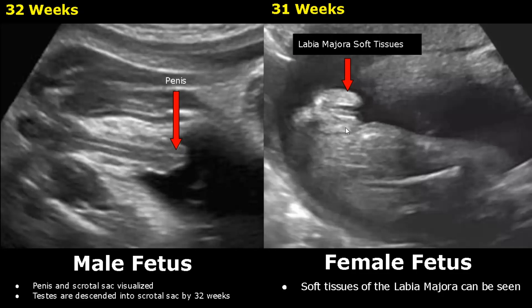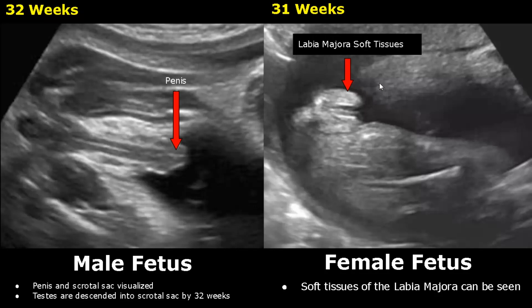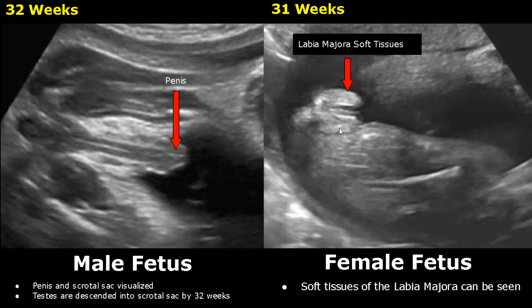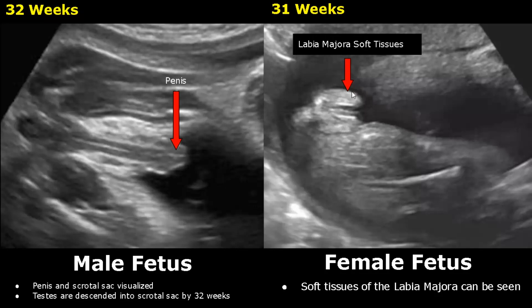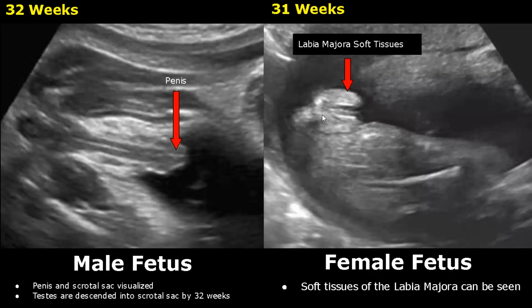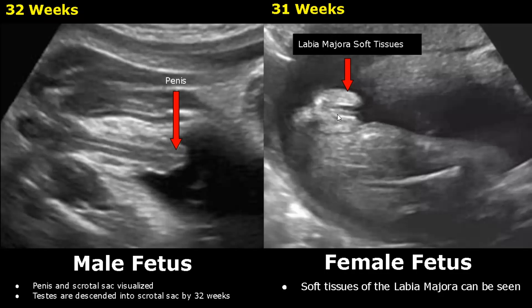Over here we have a female fetus of 31 weeks. We can see the soft tissues of the labia as well, along with the hyperechoic lines.